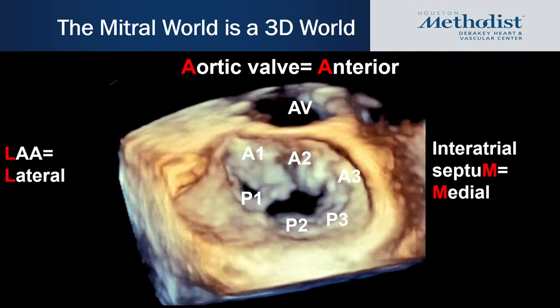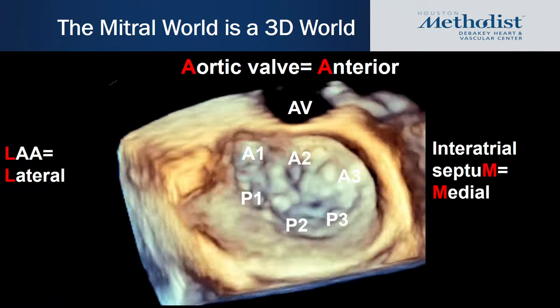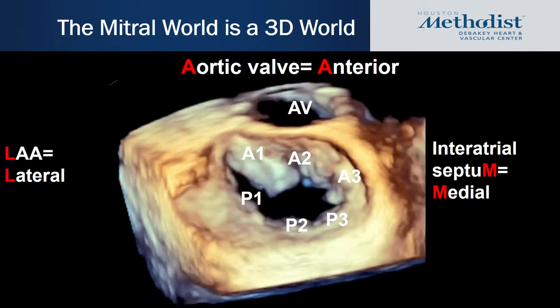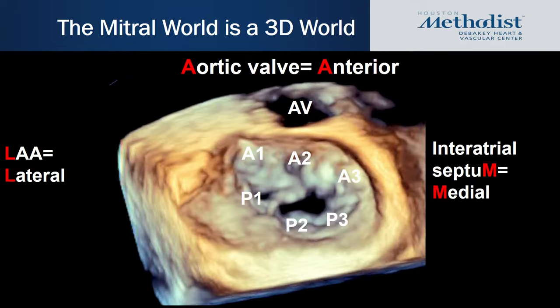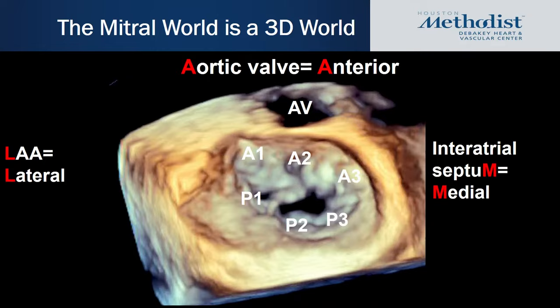It's important to remember that the mitral valve world is a 3D world, so when doing a transesophageal evaluation it's important to get an en-face surgical view showing the different components of the valve to help localize the pathology. In the 3D view, the anterior aspect is bordered by the aortic valve, the interatrial septum forms the medial aspect, and the left atrial appendage forms the lateral aspect. The scallops closest to the septum are A3 and P3, while those closest to the appendage are A1 and P1.